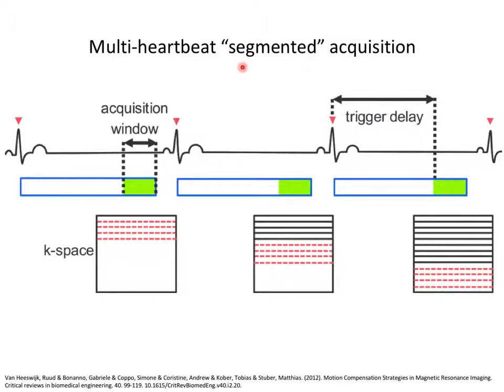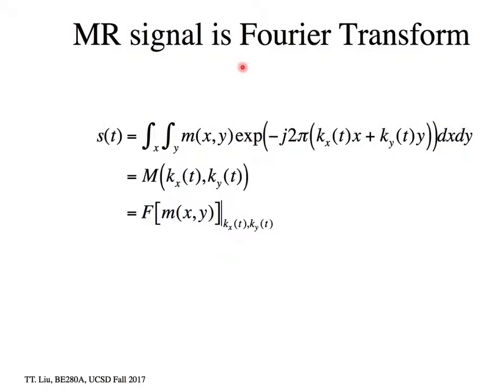So how do we get all this done in the context of imaging somebody's heart? Obviously, if we look at our signal equation here, this is our primary equation that we're looking at. That's the signal we measure in our preamplifier, etc. This is our object. So if this is the heart in the chest of the patient, one of the problems is it's not something that's stationary, right? MXY is something that's changing as a function of time. There should be a t value here because the shape of the object is changing with time.